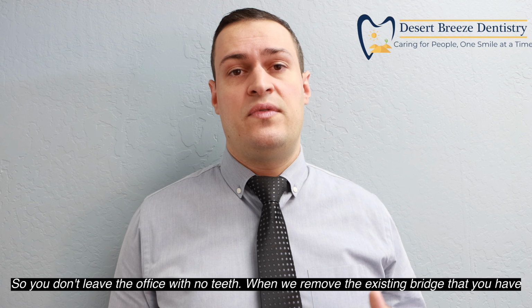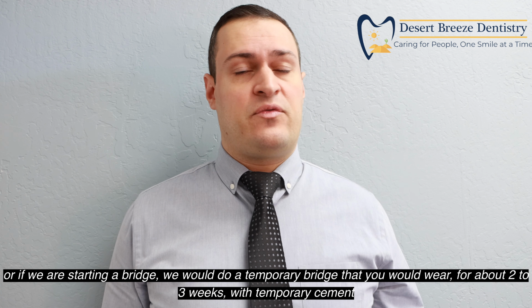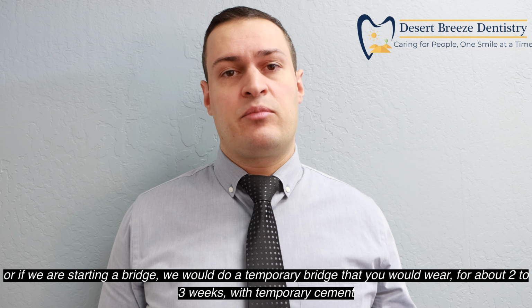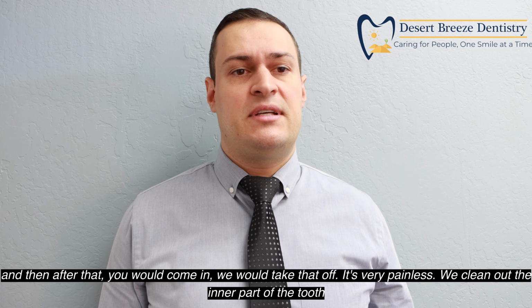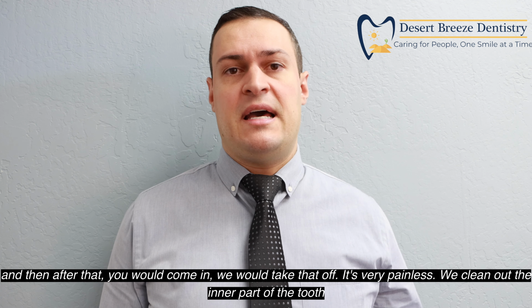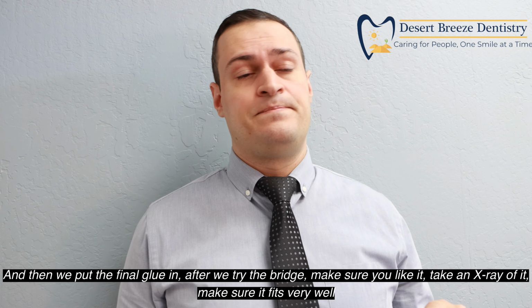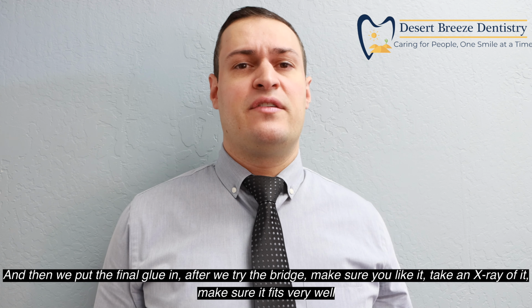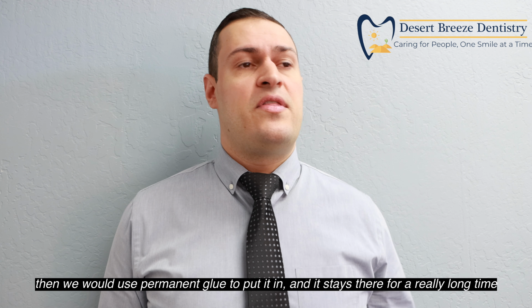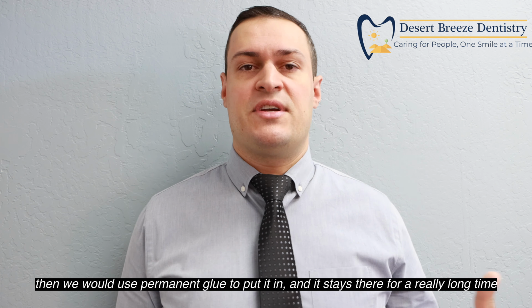When we remove the existing bridge that you have, or if we're starting a bridge, we would do a temporary bridge that you would wear for about 2 to 3 weeks with temporary cement, and then after that you would come in, we would take that off. It's very painless. We clean out the inner part of the tooth, and then we put the final glue in. After we try the bridge, make sure you like it, take an x-ray of it, make sure it fits very well. Then we would use permanent glue to put it in, and it stays there for a really long time.